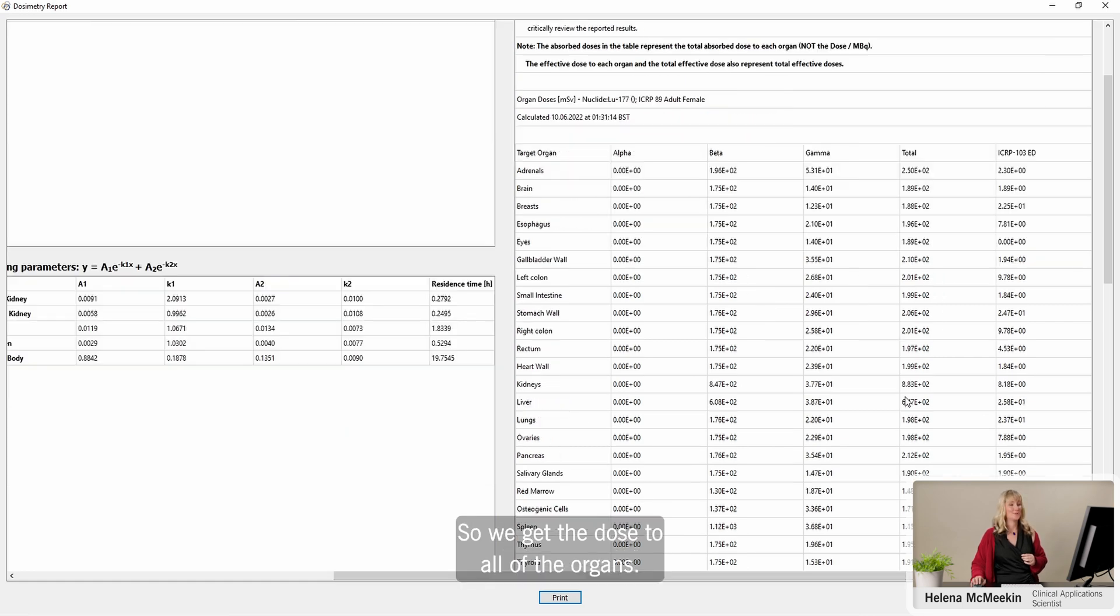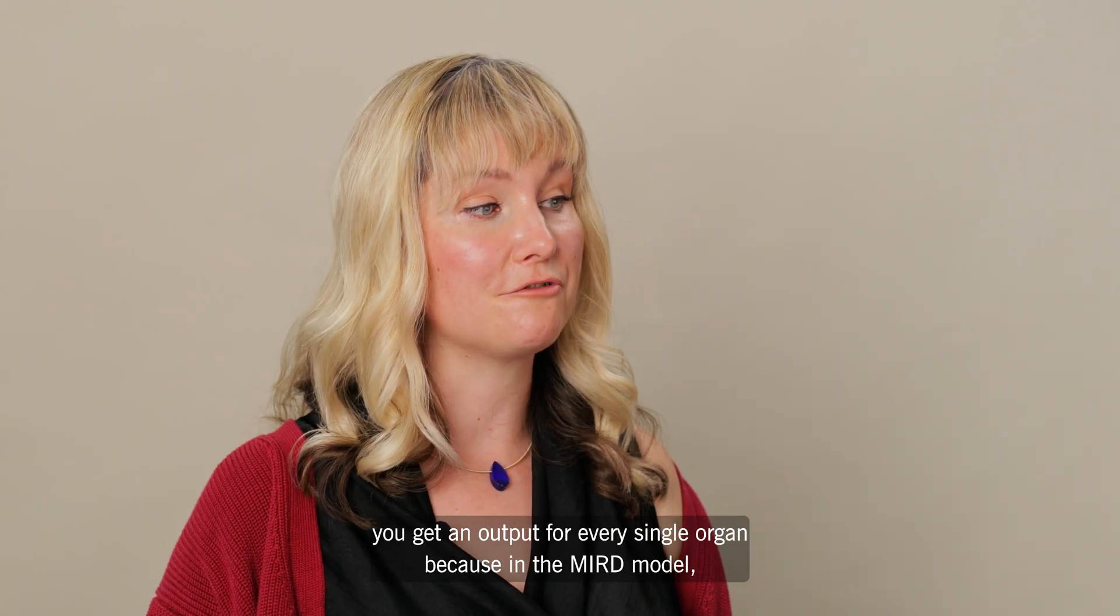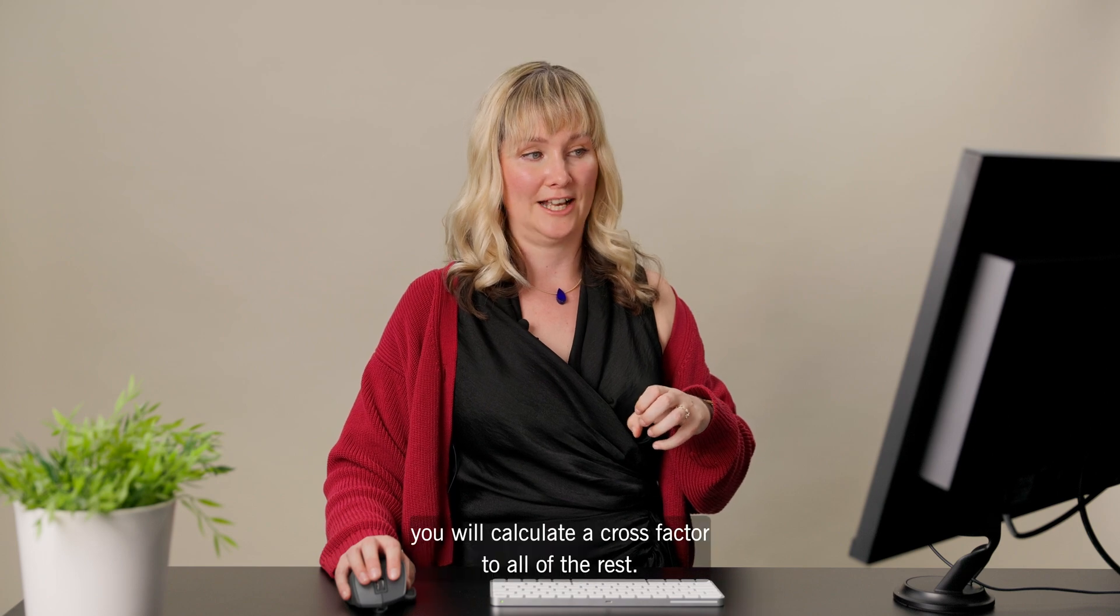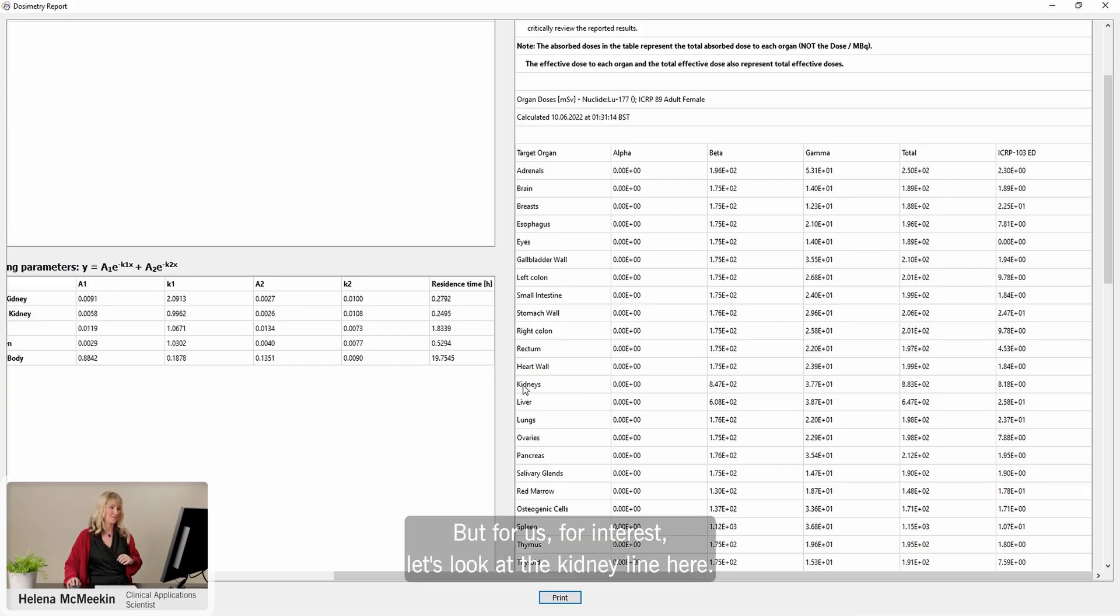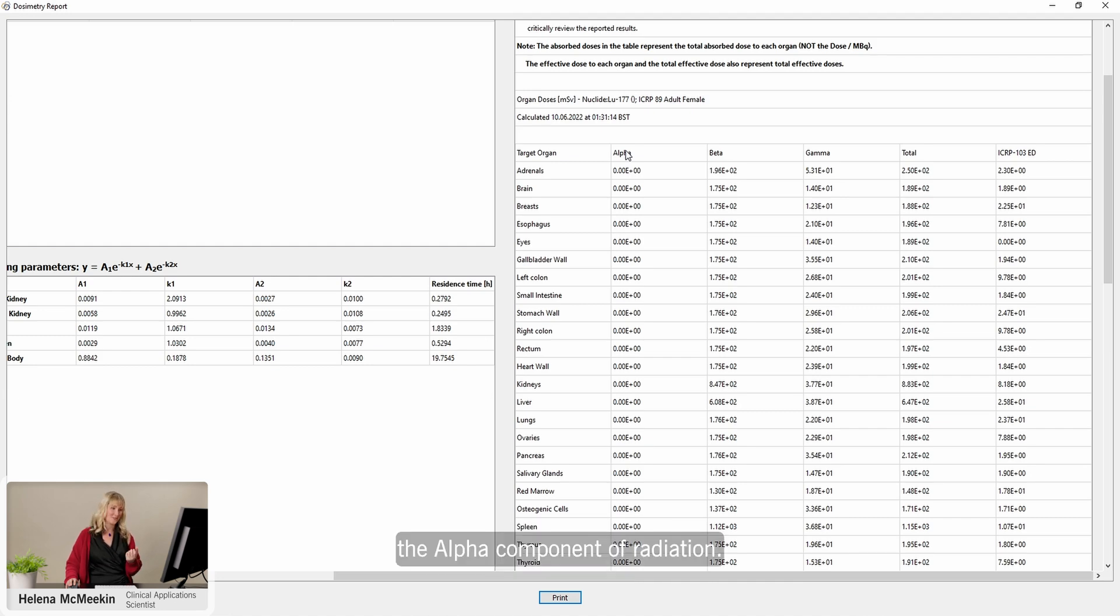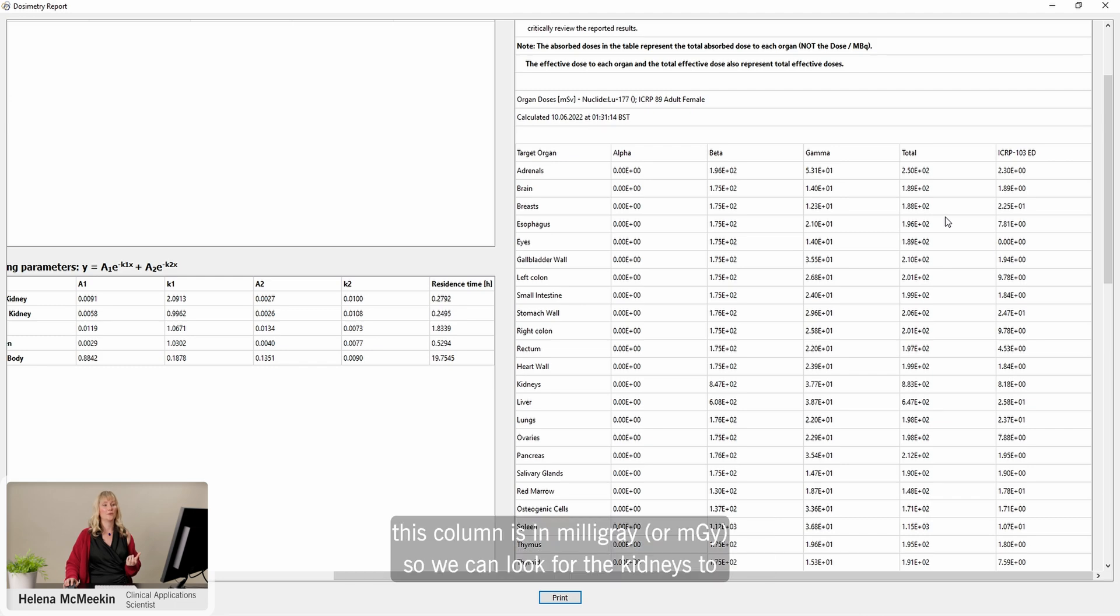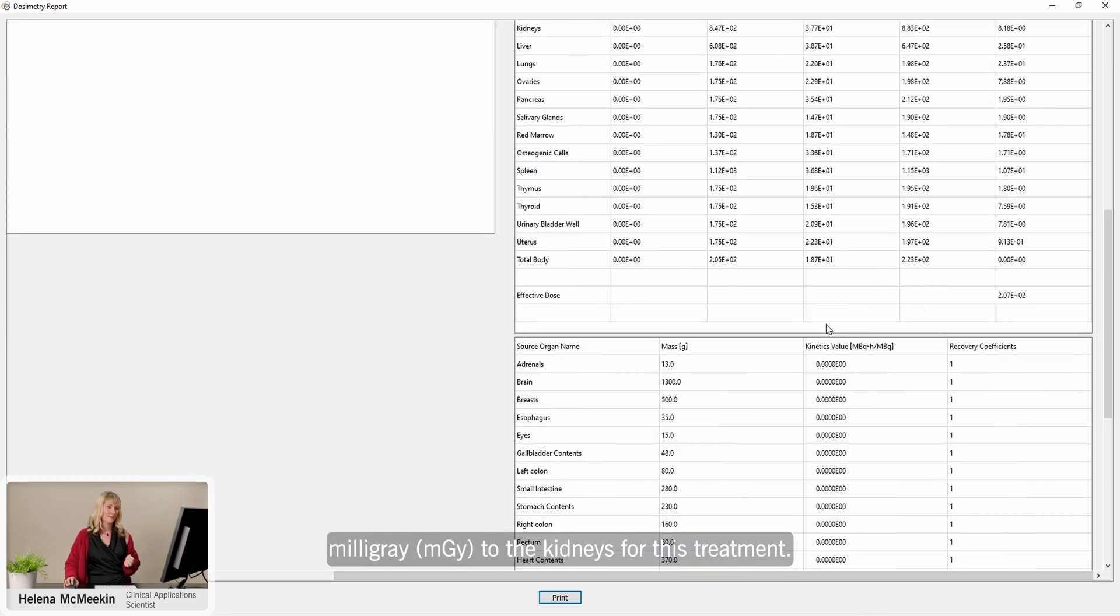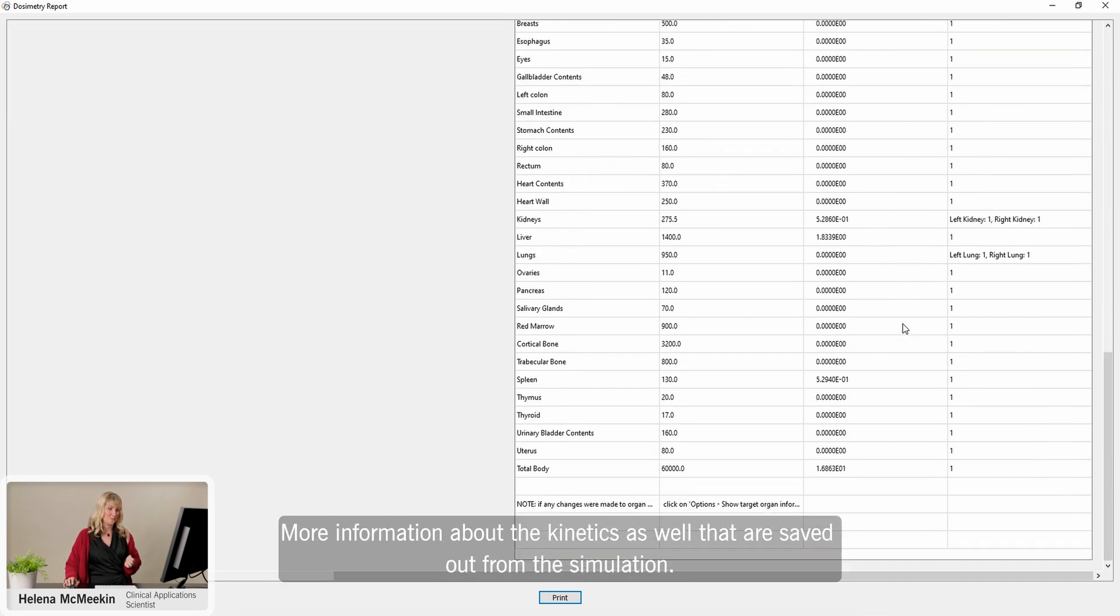And now the dose. We get the dose to all of the organs. Even though we only defined, I think, four—the kidneys, the liver, and the spleen—you get an output for every single organ because in the MIRD model, as soon as you populate one organ with activity, you will calculate a cross-factor to all of the rest. But for us, for interest, let's look at the kidney line here. We can see the contribution to the kidney dose in terms of the alpha component of radiation. For lutetium, that's nothing, so we've got nothing in this column. The beta component, the electrons, gamma component, photons, and then total. This column is in milligray. We can look for the kidneys to here. We're calculating about 0.9 gray or 880 milligray to the kidneys for this treatment.